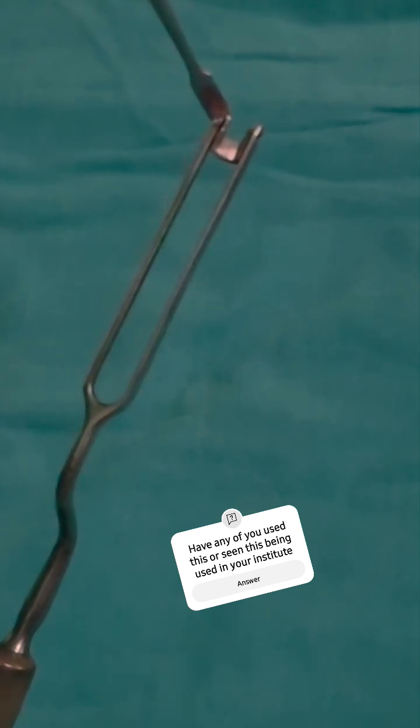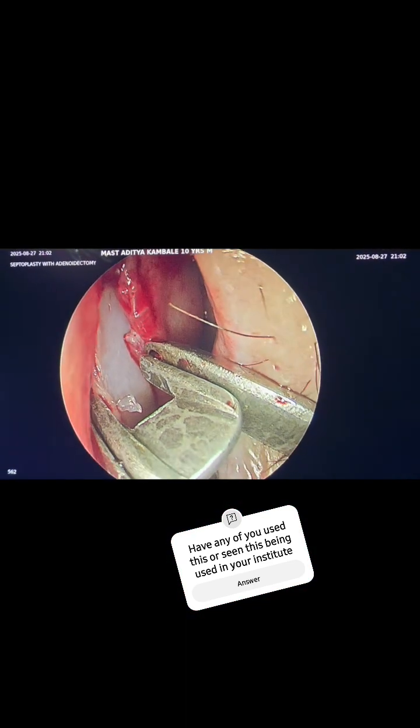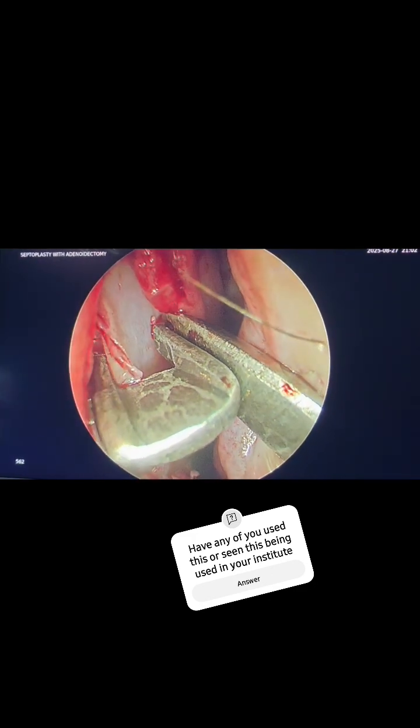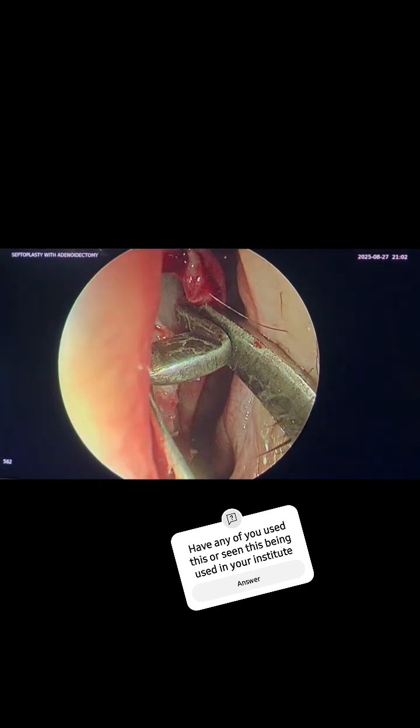We will now demonstrate how to use the Bellinger swivel knife on a patient. We can see both guards going on either side of the cartilage. I have already raised the mucoperichondrial flap, and we just have to push the instrument.